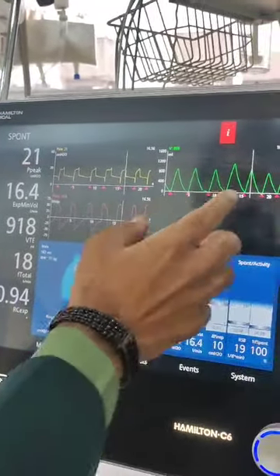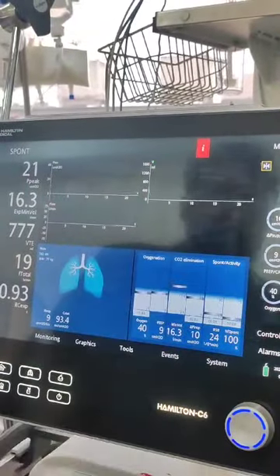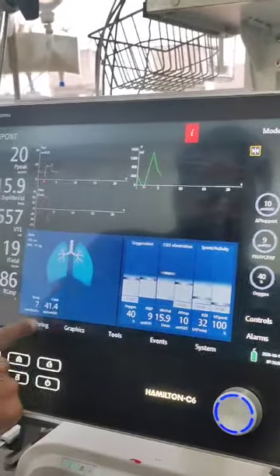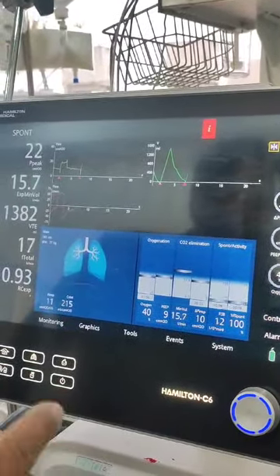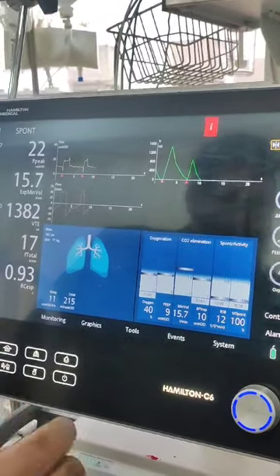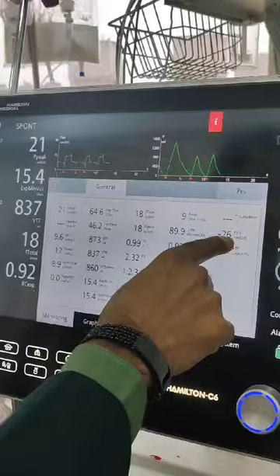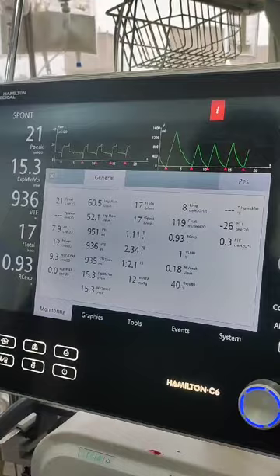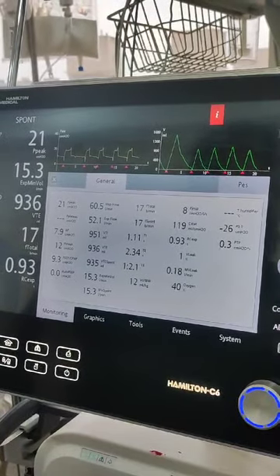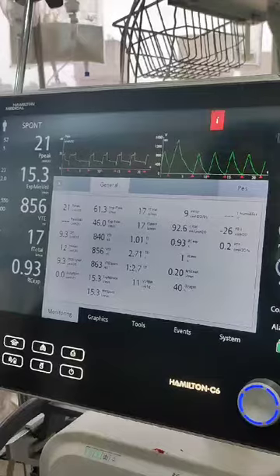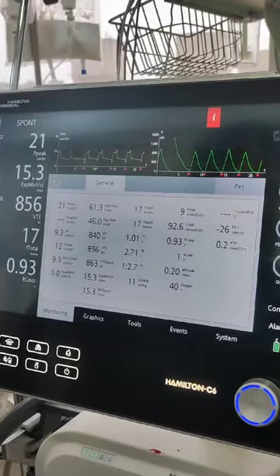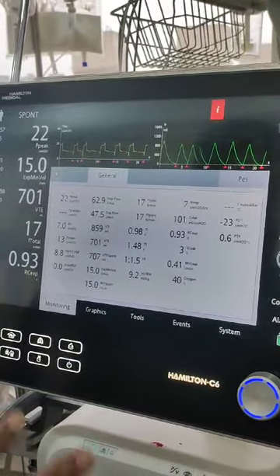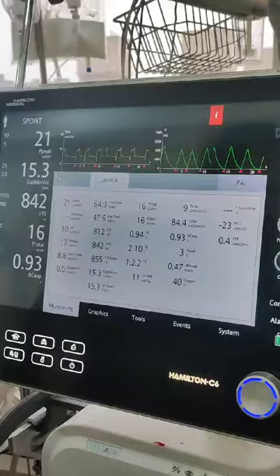You might think things are looking well, but unfortunately one metric to look at is the P0.1 — the airway occlusion pressure at 100 milliseconds of occlusion. When you look here, you have a P0.1 of minus 26, minus 23. This should be between minus 1 to 3.5. A reading of minus 23 indicates that this patient is either under-assisted or has a very high respiratory drive.